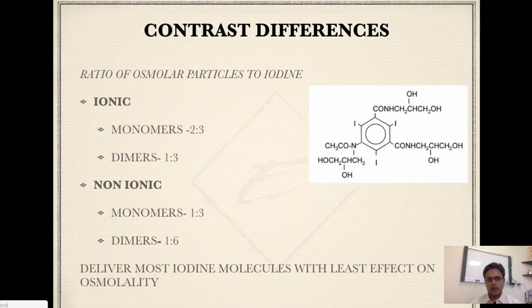So theoretically, this should be the most effective contrast we are using with the least amount of complications. But the common ones we use in our clinical practice happen to be non-ionic monomers such as Omnipaque.